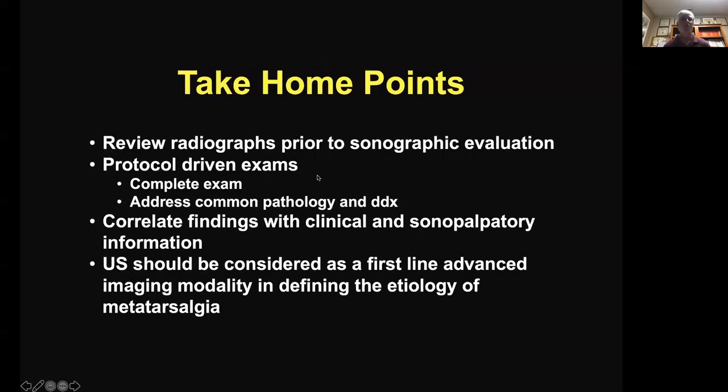So take-home points: review radiographs prior to starting your sonographic evaluation, use protocol-driven exams to meet the criteria for a complete exam, even though it's somewhat of a loose criteria, and address common pathology and differential diagnosis. Correlate findings with clinical and sonopalpatory information.